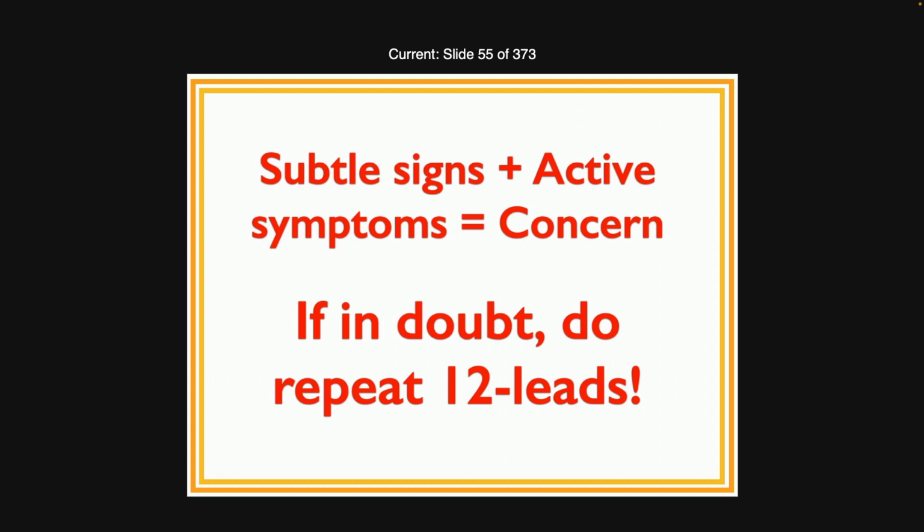If you don't have that, number one, absolutely go to whatever hospital is your cardiac hospital. I think that's obvious. You can decide code 1, code 3. I'll say code 3, because that's easy. And the most important thing with that is to be able to describe it. So if you transmit your 12 leads, again, you're golden.